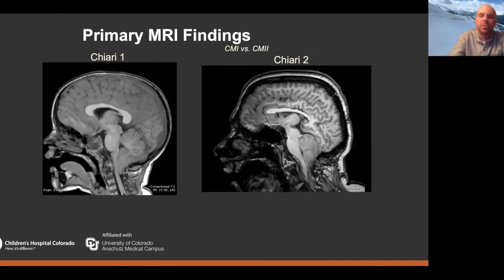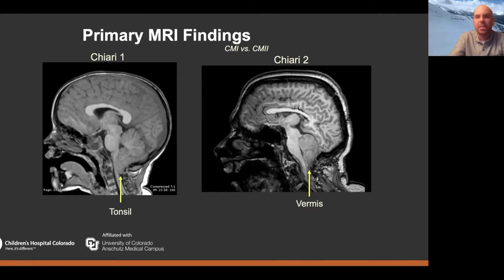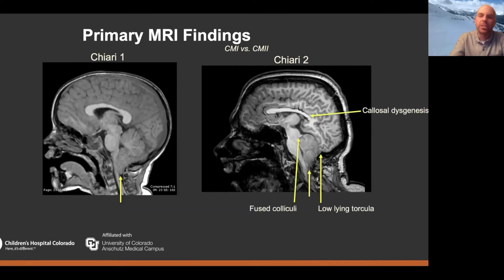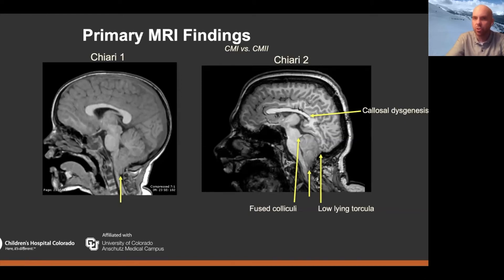Looking at this with imaging, the patient on the left has a Chiari 1 and the patient on the right has Chiari 2. They both show herniation of some aspect of the inferior cerebellum — the tonsils in the case of Chiari 1, the vermis in the case of Chiari 2 — at the foramen magnum and into the cervical canal. However, you start to see differences: the rest of the brain in the Chiari 1 patient is pretty normal, while the Chiari 2 patient has callosal dysgenesis, fusion of the colliculi — that's the term beak tectum — and a low-lying torcular herophili. That last feature is very important surgically when considering how much bone to remove during suboccipital decompression before potentially encountering critical structures — a really surgically and anatomically relevant feature.